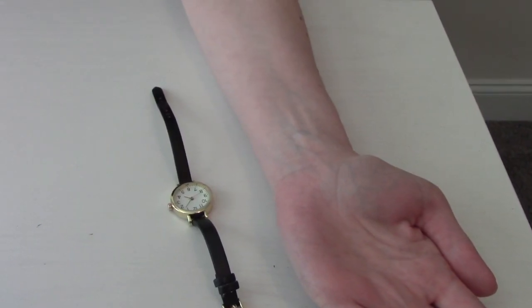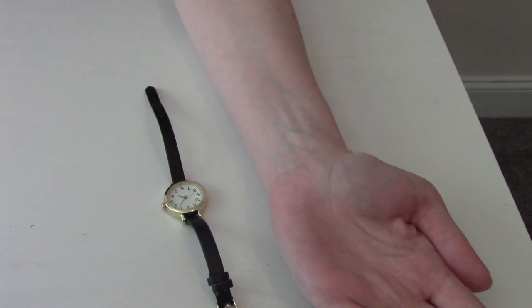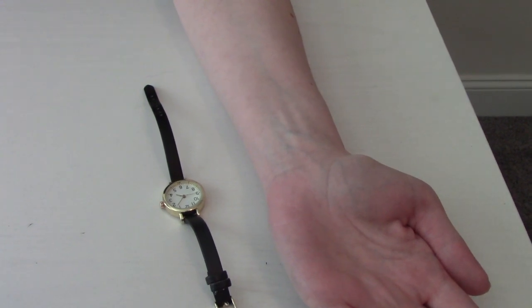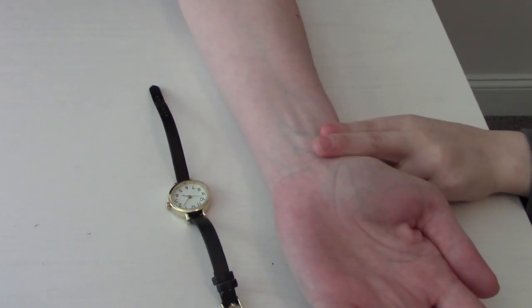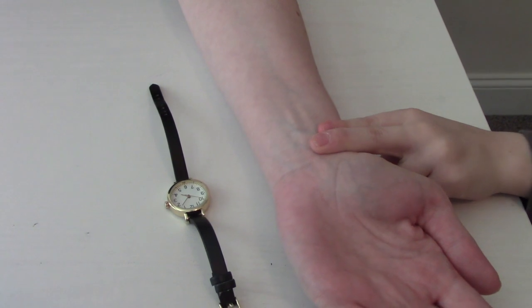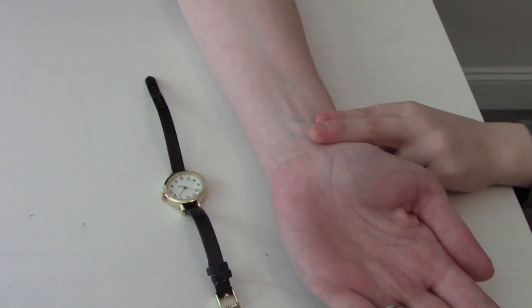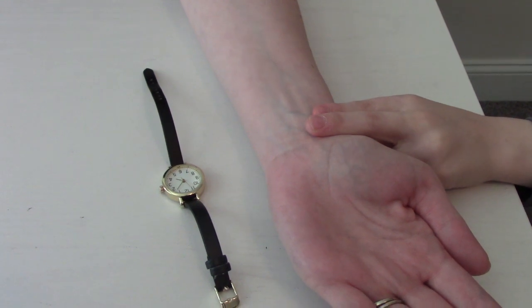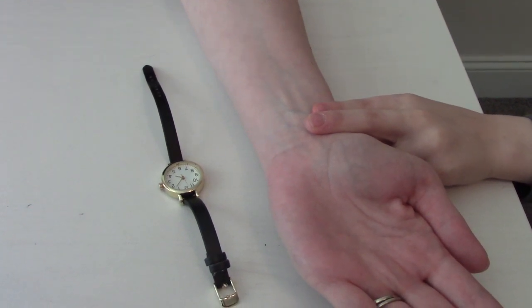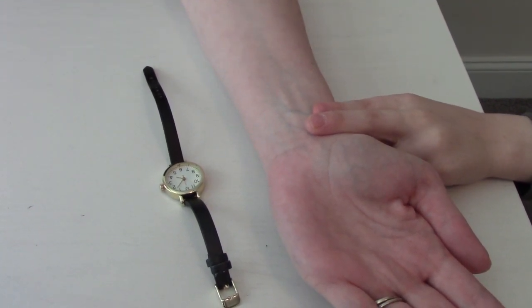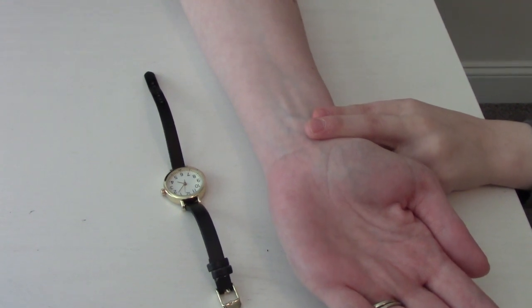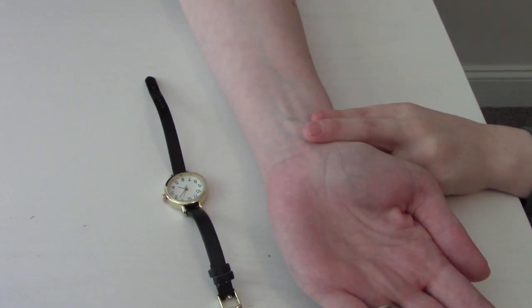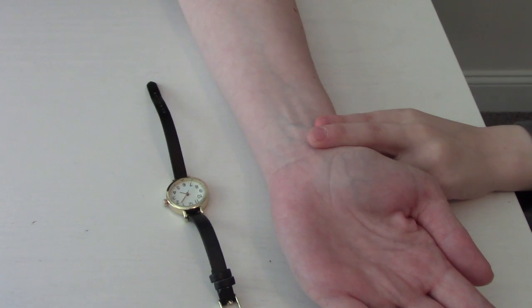To take somebody's radial pulse, you're going to see their thumb and then put two fingers slightly below onto the wrist. You're going to palpate for 30 seconds and then double that. So for example, if you palpate and you get 32, you're going to double that to 64 and their pulse will be 64. If there's any irregularities at all, you want to palpate for a full minute.